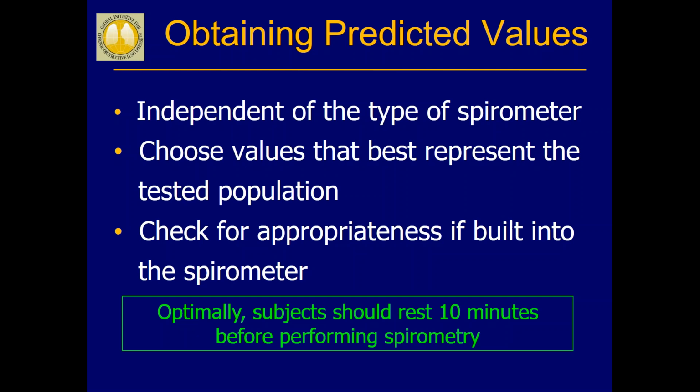And because spirometry is very effort-driven, you should have the patient rest 10 minutes before the spirometry. They shouldn't be running from the car, from the parking lot, going to the office, and going straight to spirometry. So again, in terms of planning, you would want to consider other activities for the patient to do, a sedentary activity, before doing the spirometer. And then if you have a bronchodilator given, you might want to have another activity for 10 to 15 minutes and then do the post-bronchodilator. So there's a little planning and logistics involved, but if you get the workflow through, it should be beneficial for your practice and the patient.